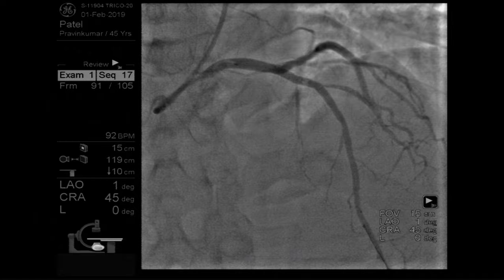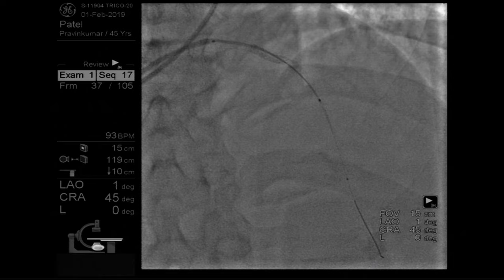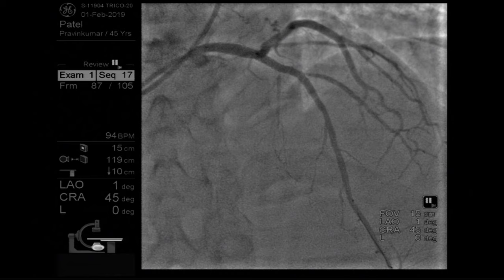Angio co-registration is a beautiful thing to have in the cath lab. Whenever you want to evaluate a particular spot, you know exactly where it is, and this can really help. We just connect to the angio and mark the distal tip, the imaging portion, and then the proximal, and we can get an angio co-registration. Here you can identify the marker of the lens. Here we can obtain the image, right?